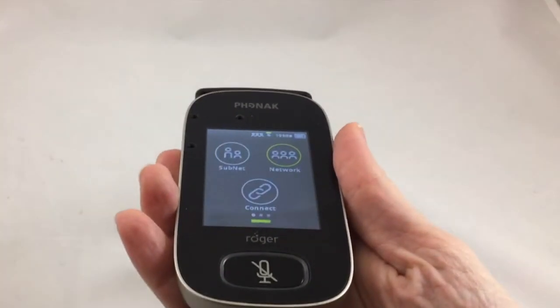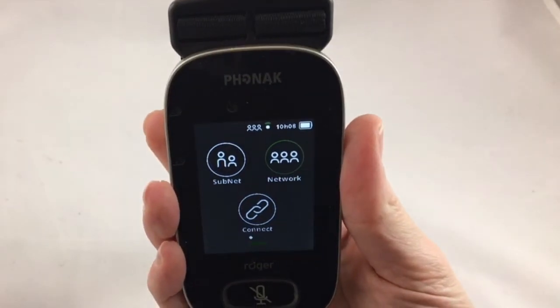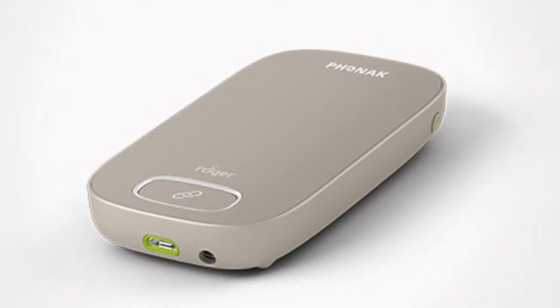Remember, if the Multimedia Hub is connected to a Roger touchscreen mic, the mic needs to be in lanyard mode for it to work. Do not set it down on a table or it will switch to small group mode and the Multimedia Hub won't work.